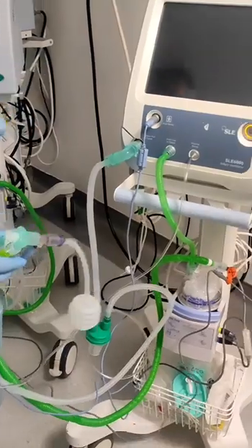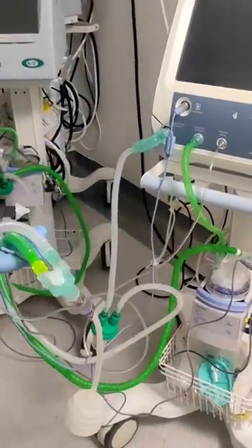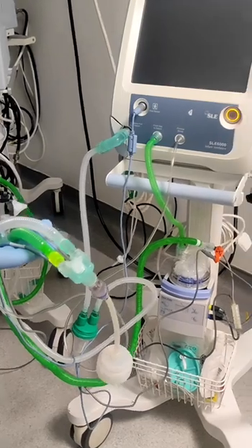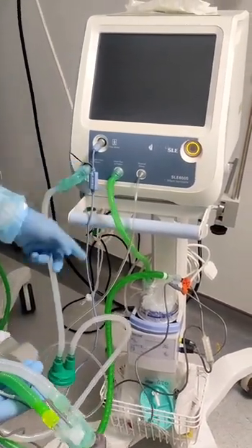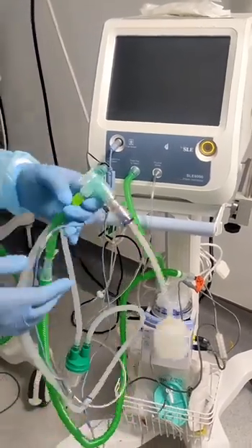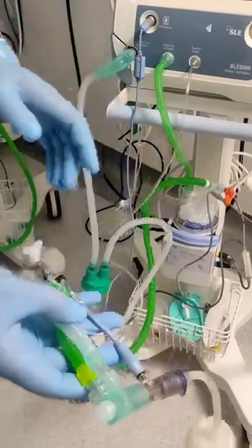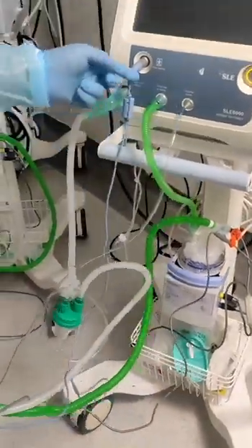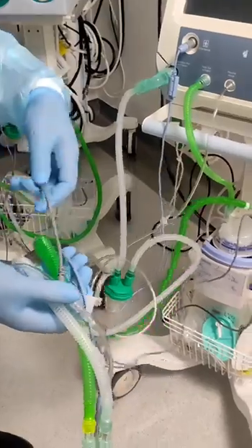Hi, this is the SLE 6000. Now we use the circuit — double limb, dual limb. The inspiration is the green one and the expiration is the white one. We also use the flow sensor and the proximal pressure. The proximal pressure is here, the flow sensor we connect here, and this is the heated wire.